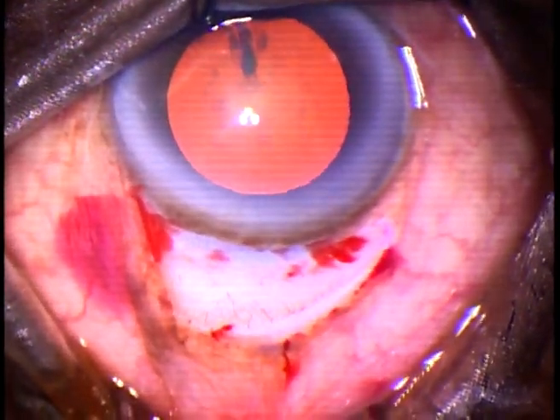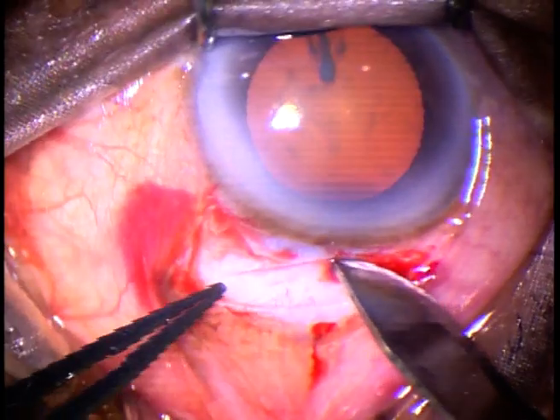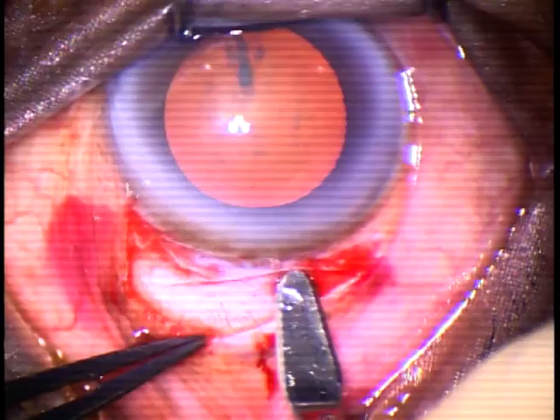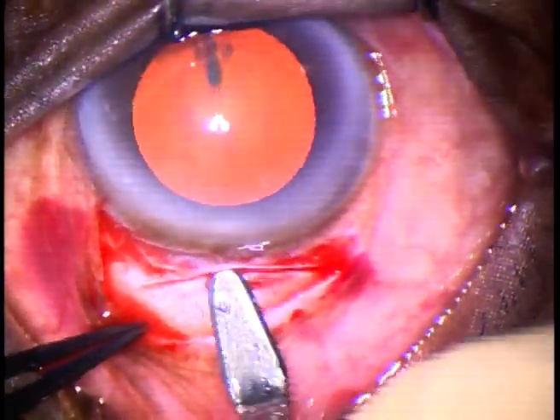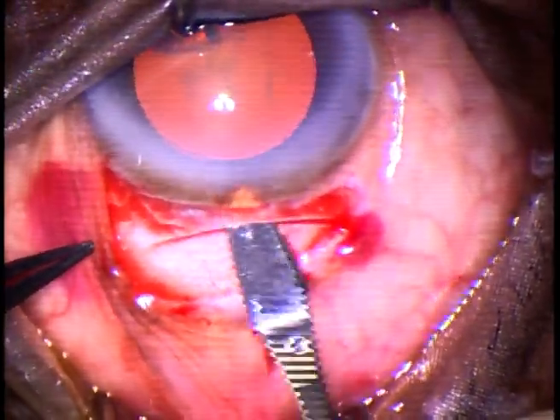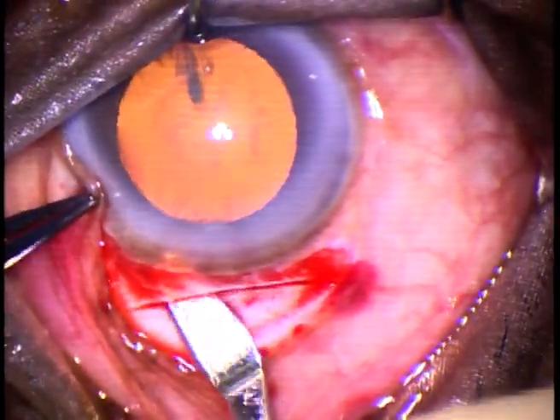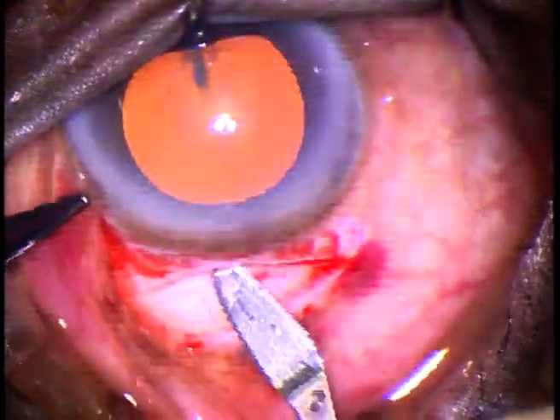And now, put the main incision. This is a 15 number Bard-Parker blade. This is an incision of about 5.5 millimeters. In this case, we are going to put a lens of 5.25 millimeters, so a 5.5 millimeter incision is good enough. The nucleus is soft, so it will come very easily through a 5.5 millimeter incision.